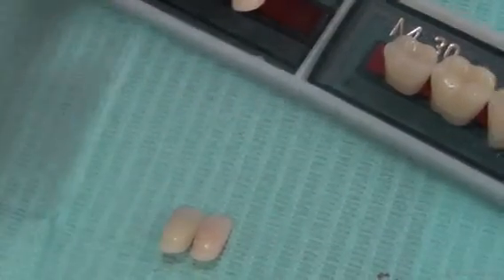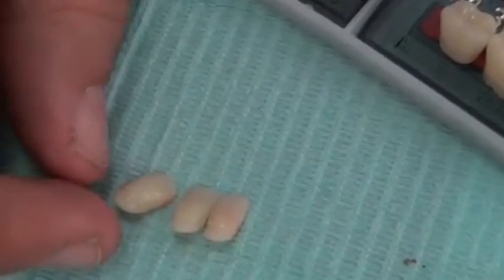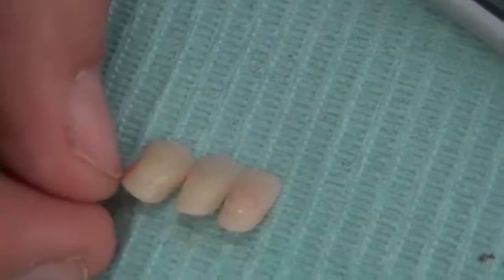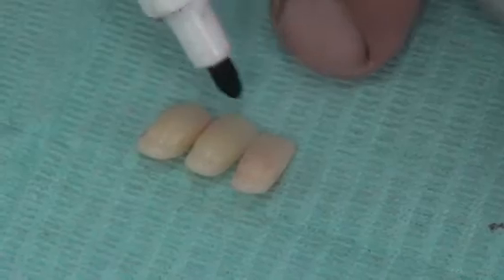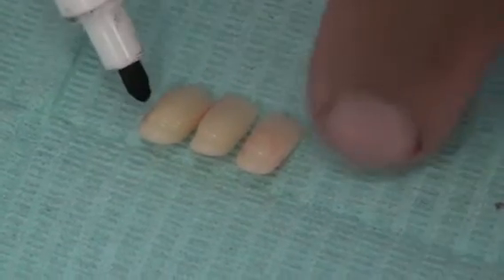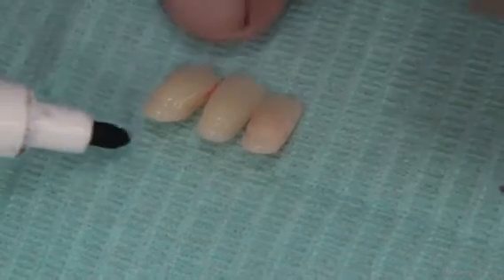When I place the canine with them, the canine is distally angulated, but how much do I angulate it? It's determined by the distal surface of the canine. If I angulate it like this, for example, this has shifted the angulation, so I'm going to readjust the lateral to be straight, the central should be straight, and the canine, I'm going to adjust it in the angulation where I have the distal surface of the canine going with the line that we had.